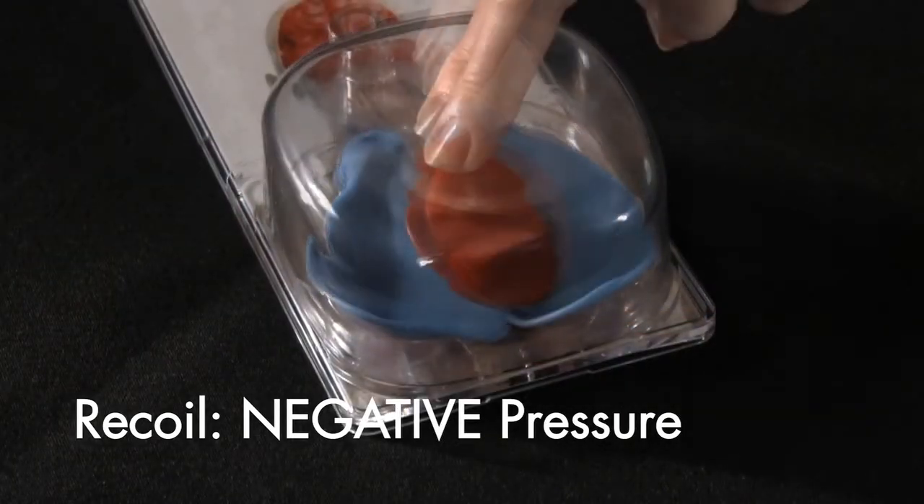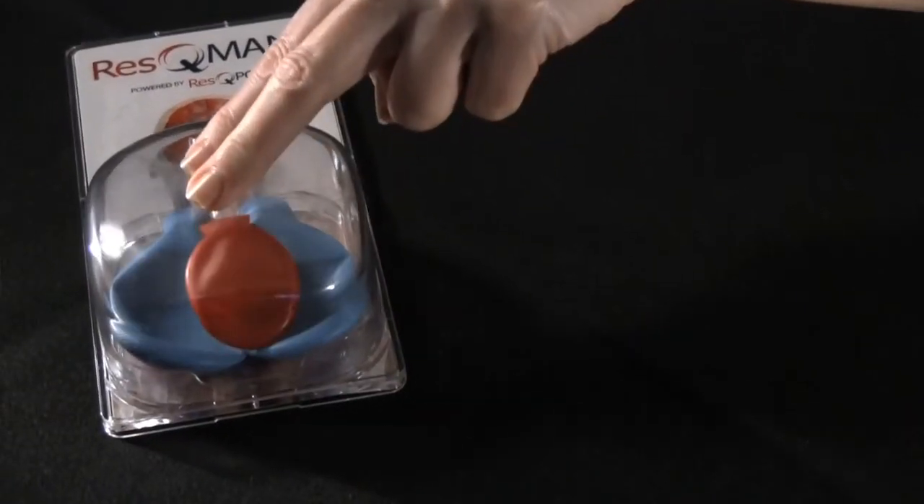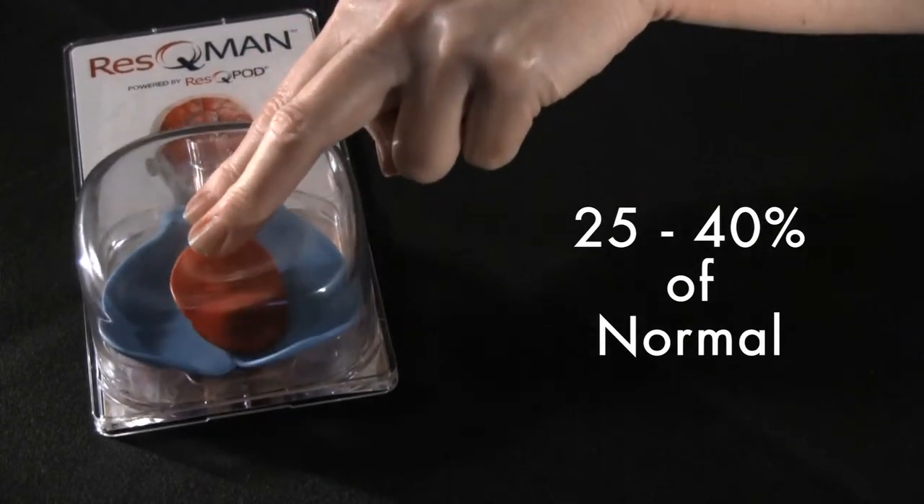This phase of CPR is crucial because the more blood that can be returned to the heart, the more blood that can then be circulated forward on the next compression. However, even with high quality CPR, we only circulate 25 to 40% of normal blood flow.